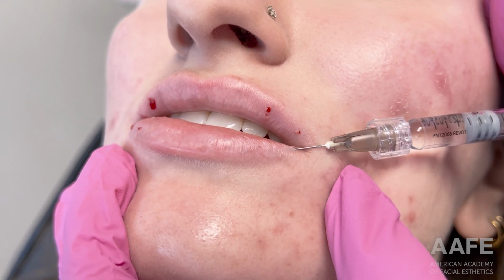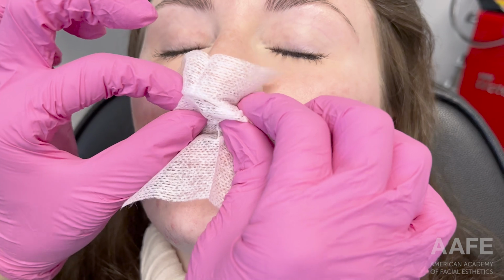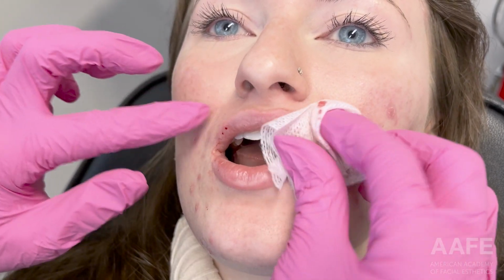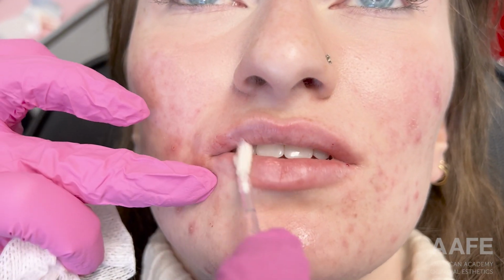We are not going to quite finish the syringe. I never put more than one syringe in one sitting. That is just my personal treatment restriction. I want to build these lips gradually over time, and I don't want her to get too swollen. So I don't place all that much filler at each treatment, but you can see here we have achieved some beautiful results.